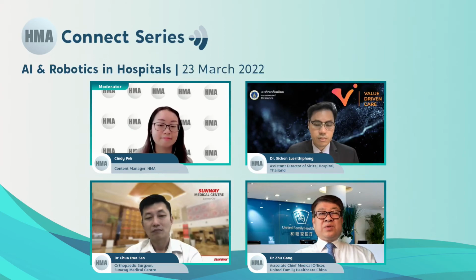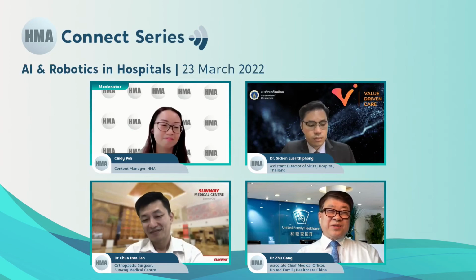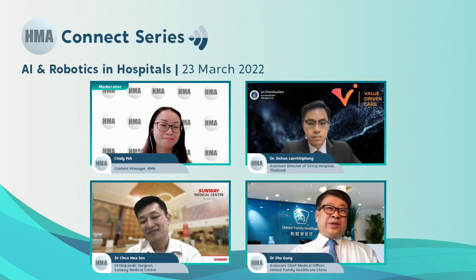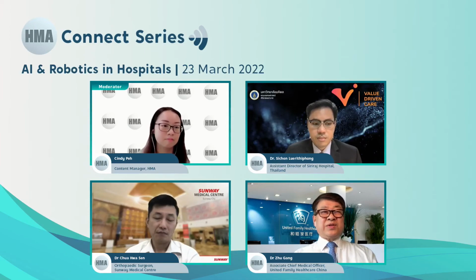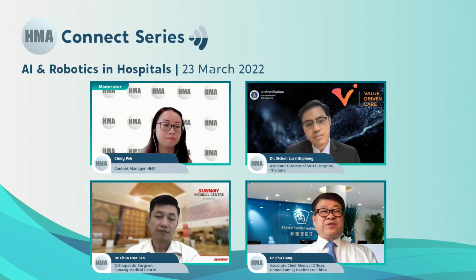For the robot, it's something new. Previously, with open surgery, maybe we could walk on the street; with laparoscopic surgery, it's like you ride a bike, and then a new car comes. So you need a license, you need to be trained, you need to know how to use it properly. This is a requirement, not only for the system but also for the surgeons and the next generations. And there are a lot of challenges, because someone who can only do robotic surgery doesn't know how to do open surgery. If complications happen, how do you deal with that? This is a challenge to the medical system. So we really need to train them, not only to use robotic surgery but also to do open surgery.